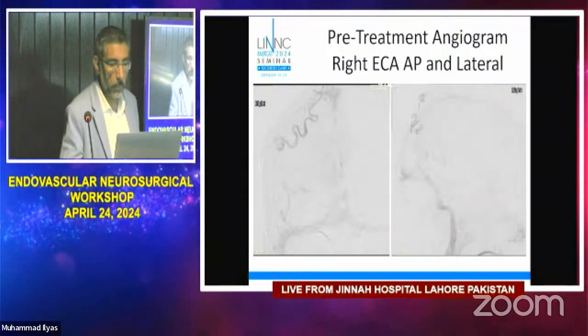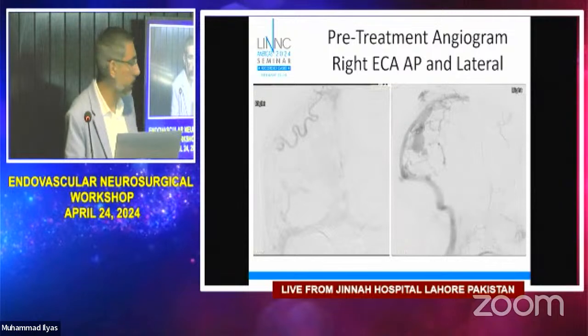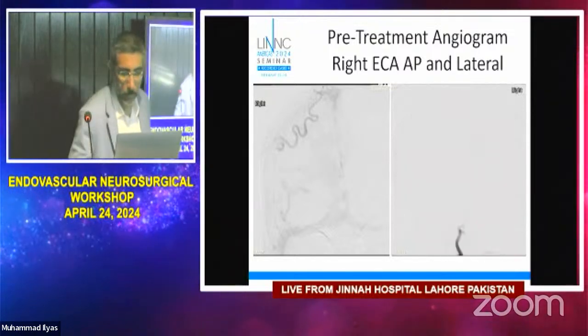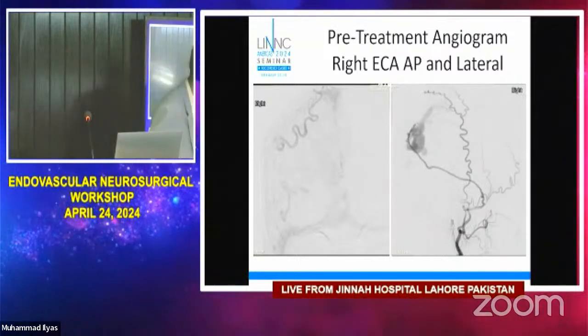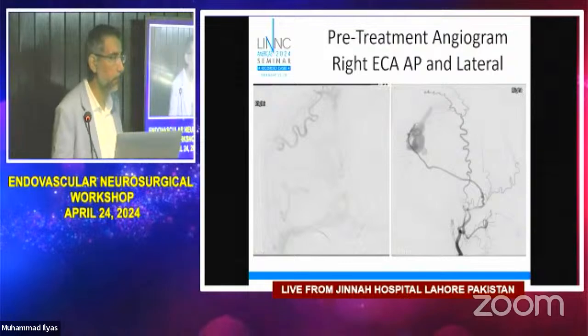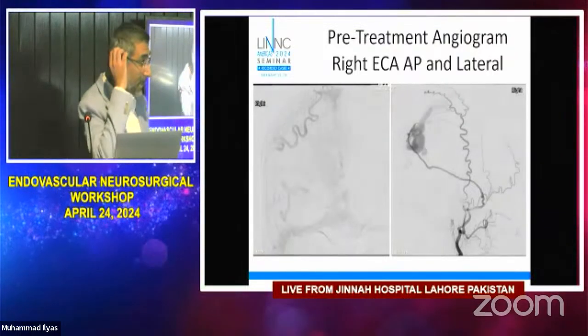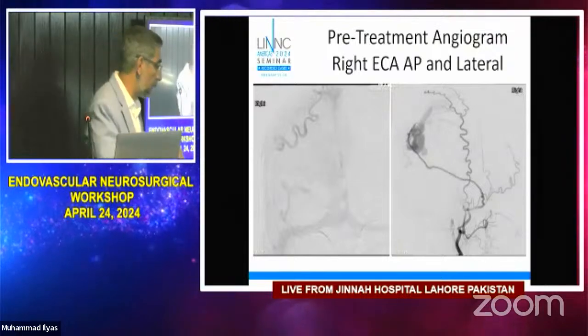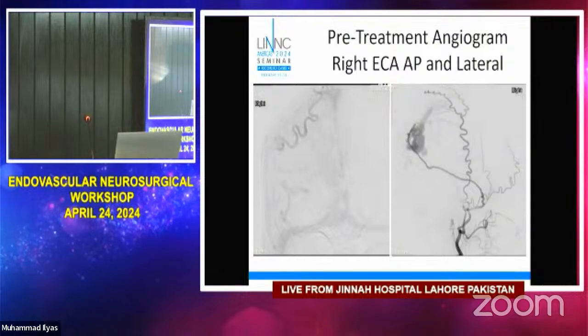So now what are you going to do? It's basically venous, small, I don't know if you can see this. You've got a daughter aneurysm right here, right? So it's an extremely high risk for rupture. Sure, you can open his head up. His middle meningeal is right here, and the vein is right there.